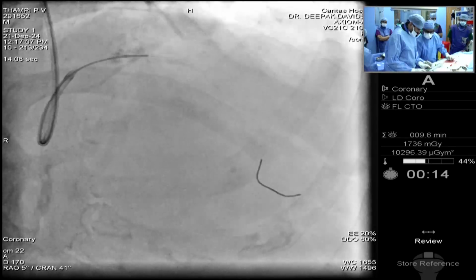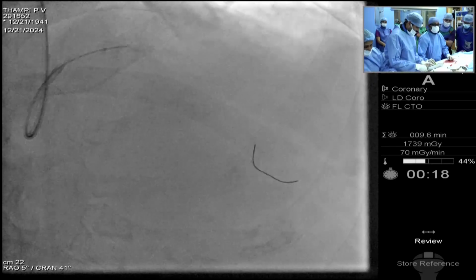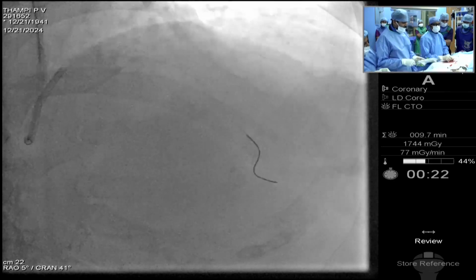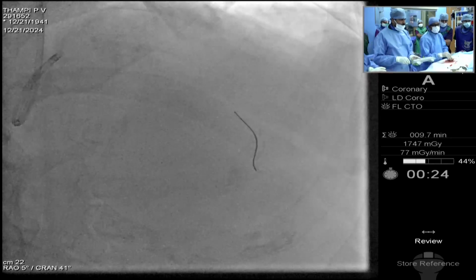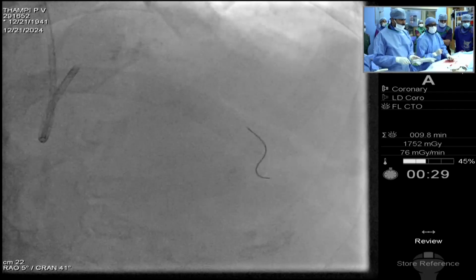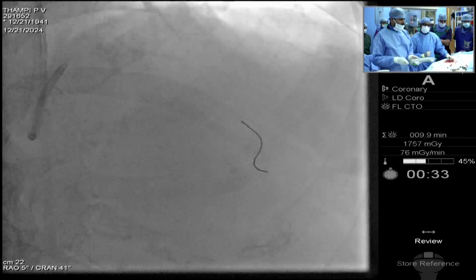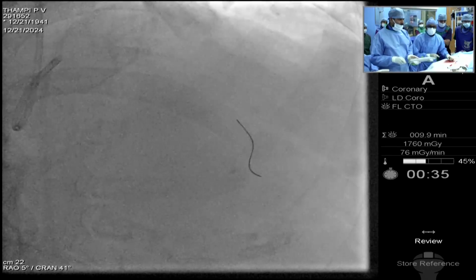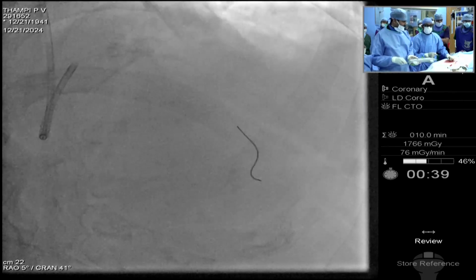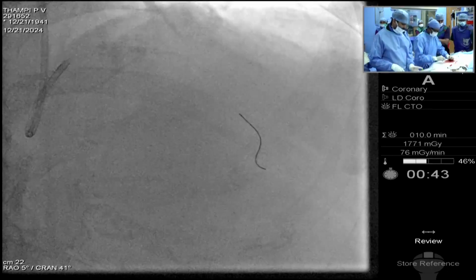Glide assist. Okay, keep pushing the wire. Keep pushing the wire. Push. It shouldn't come proximal to the bend. We'll keep it further distally. Keep pushing it. As you keep pushing it, it just comes out. You don't really have to pull it out. Now, small NTG, a shoot, microcatheter, and we'll exchange the wire. Oh, it's come up.